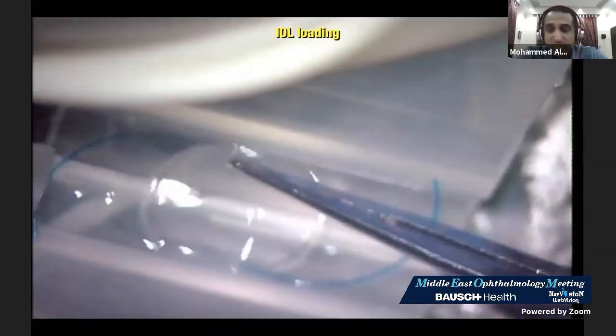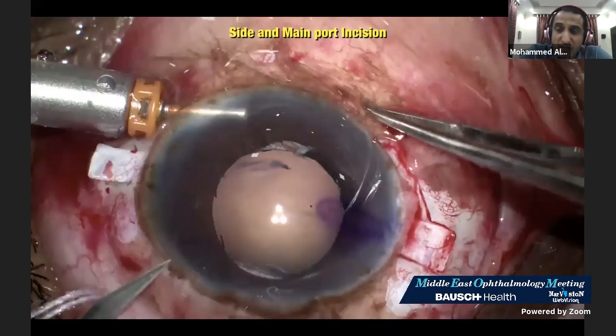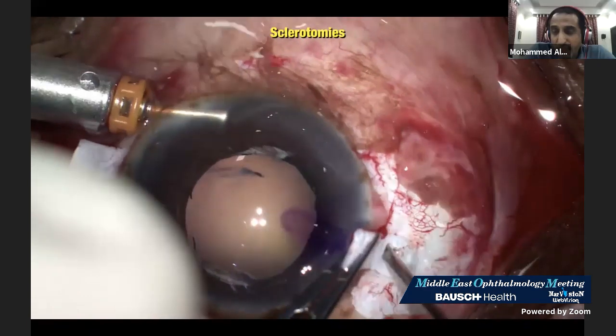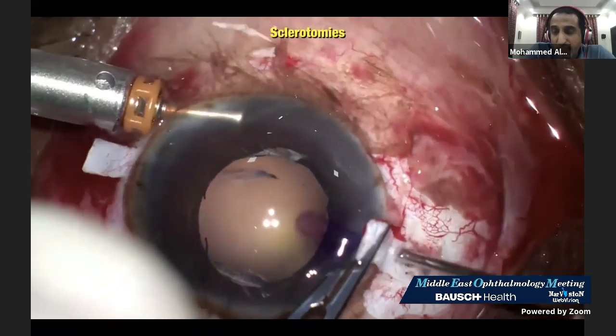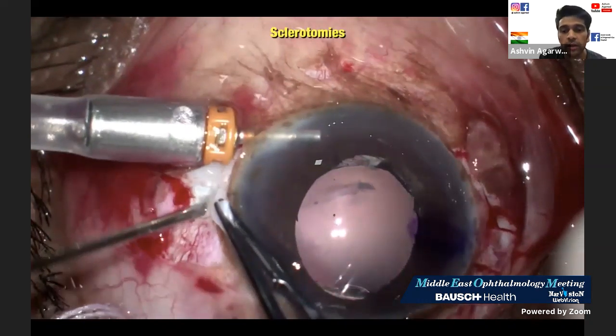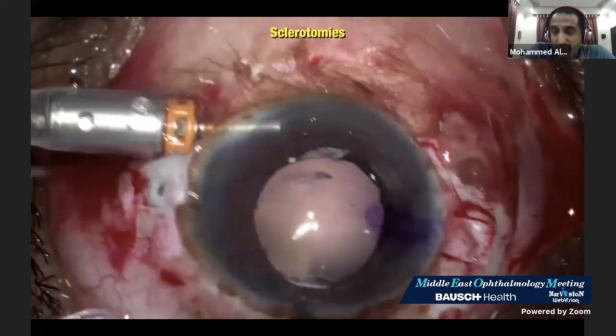Yes. I have a question, Dr. Ashpen. The one you are doing under the flap, how far from the limbal area, or in the center of the flap, where will you go? Okay, so here, again, if you do 0.75 the penetration is going toward the center of the globe, the back of the eye. Yes, back of the eye. You can even aim at the macula. Are you with me? Are you hearing me?